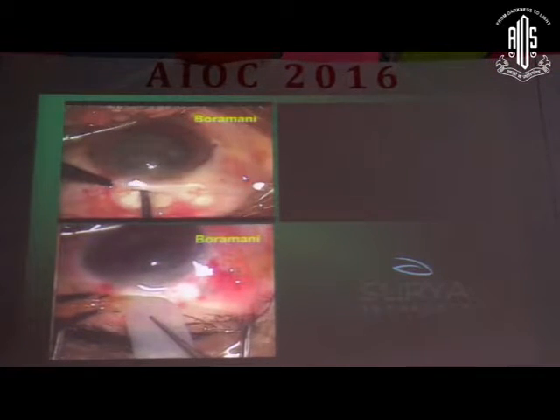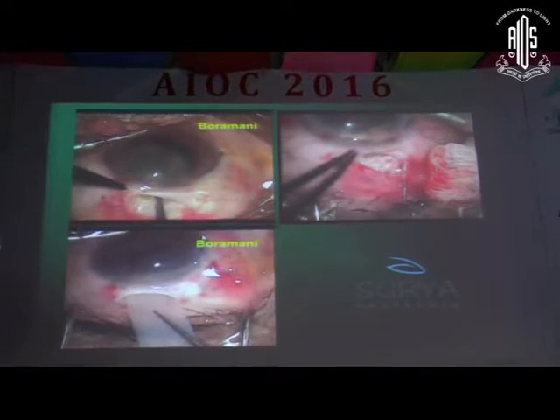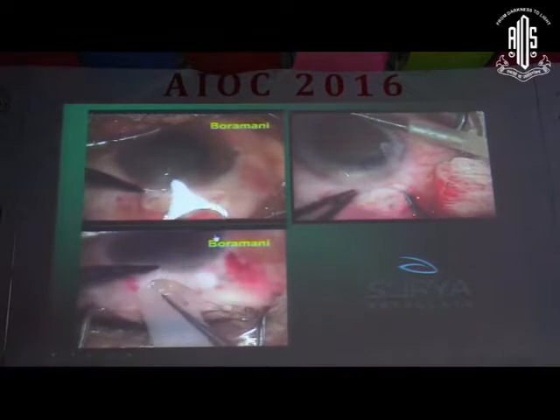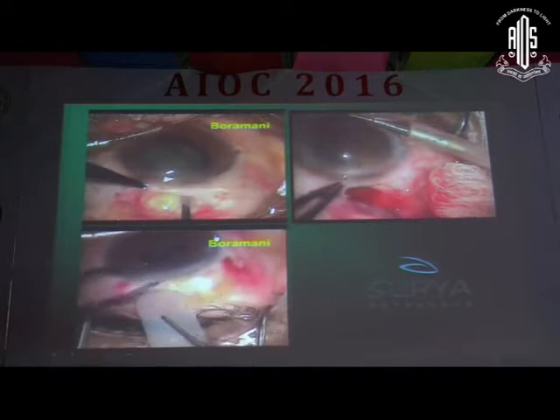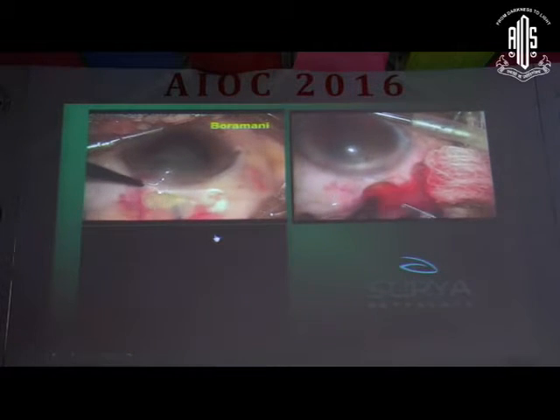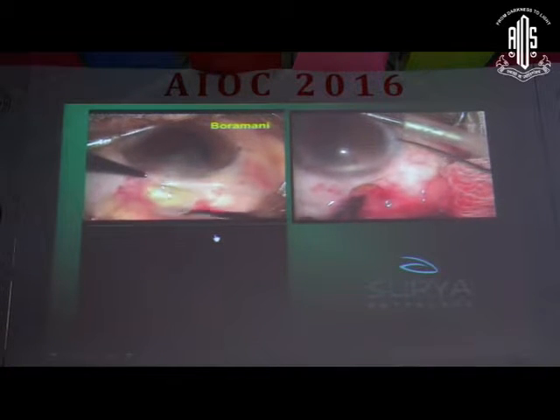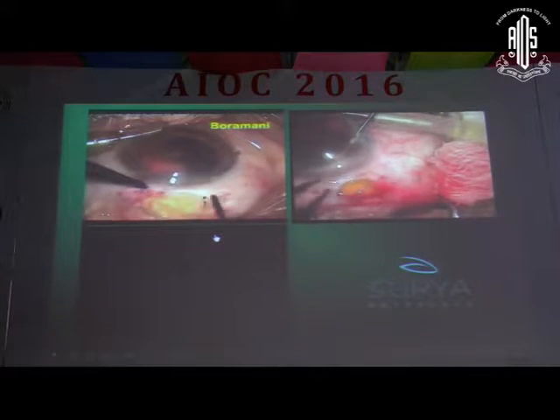Here are a few videos which demonstrate how the anterior chamber maintainer prevents the entry of blood into the anterior chamber. In all these videos, there is bleeding into the scleral tunnel wall, but because of the anterior chamber maintainer, there is always a gush of fluid from inside out, and the blood is prevented from entering the anterior chamber. In the video on the right top corner, I am delivering the nucleus. There is bleeding in the tunnel, but it is prevented from entering the anterior chamber.